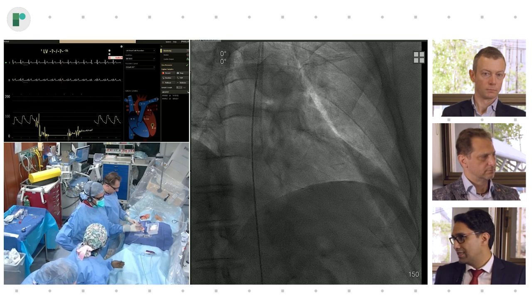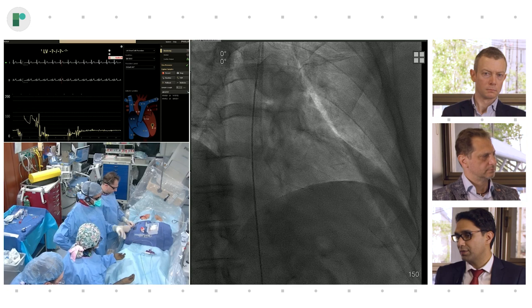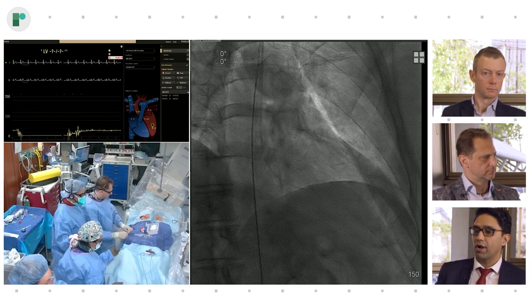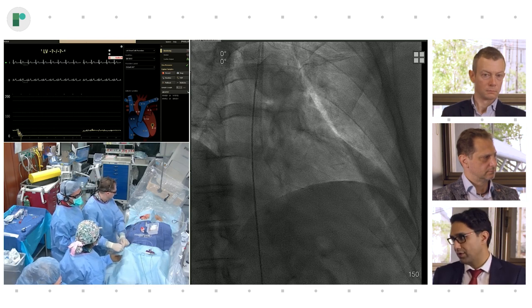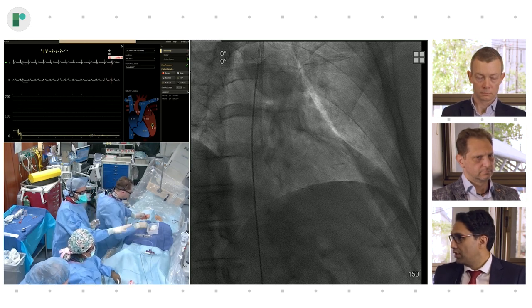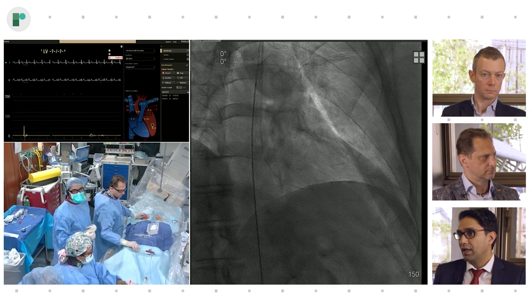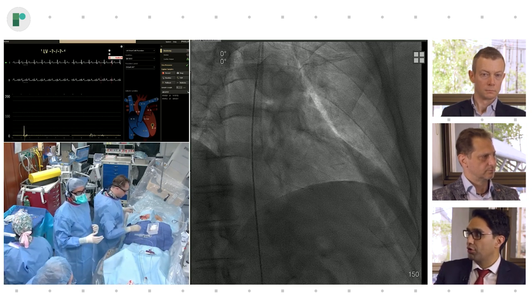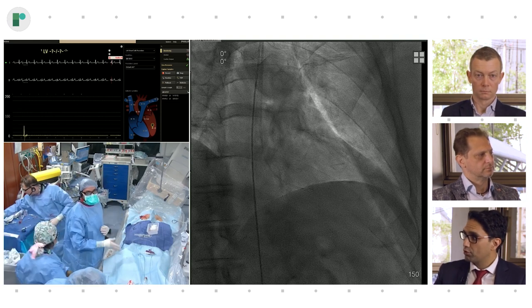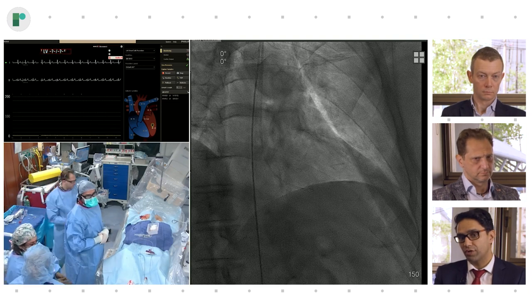We did 100 consecutive patients where we performed right heart catheterization and end-diastolic pressure measurements and did a clinical examination of the patient to determine whether we thought they were overhydrated, underhydrated, or perfectly hydrated, or euvolemic, so to speak. And there was absolutely no correlation. So we can't tell when a patient is adequately hydrated. In fact, it ended up being a third, a third, a third. A third of the patients were in the perfect EDP range from 12 to 18, a third were under and a third were above. And so what we do is we do intra-procedural hydration here.